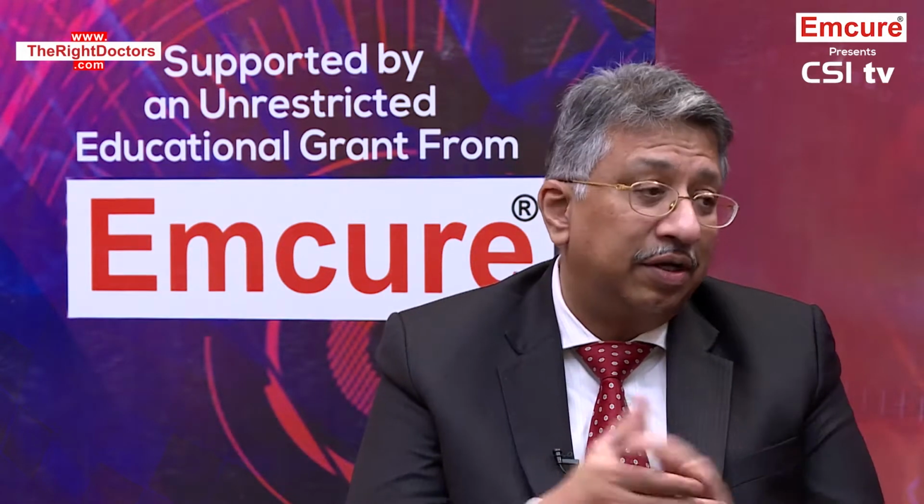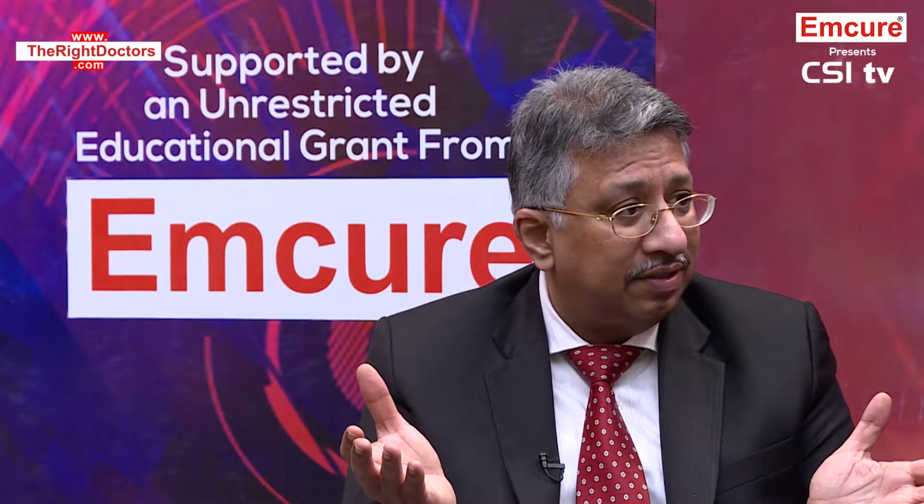Intravascular ultrasound has defined some criteria to find out if your left main is significant. The Spanish and the Americans have said it's roughly around 6 millimeters square, while from Asia, from Korea, Dr. Park has put that figure as 4.7. Now, what exactly is it in India? We are not too sure. However, I think we must caution here that putting an absolute figure and saying that less than this, the left main is significant, is erroneous. Because some people have large coronaries, some people have smaller coronaries. So, one figure does not fit all.